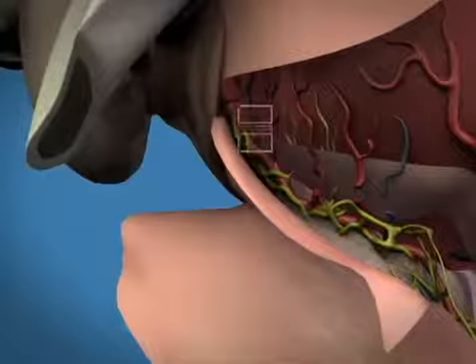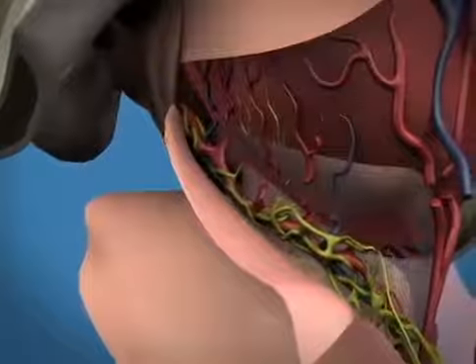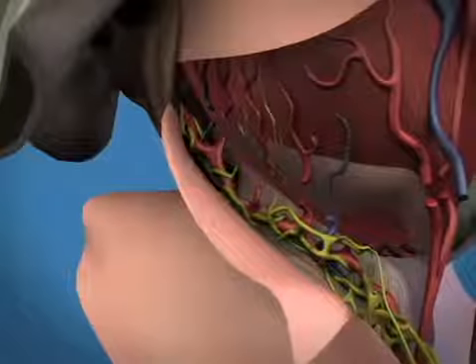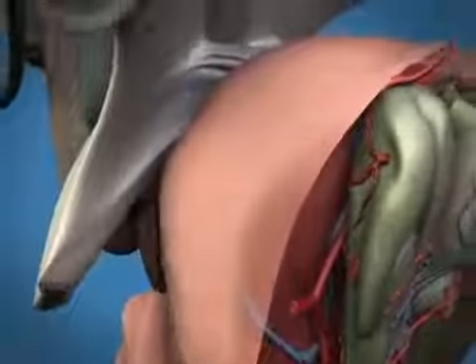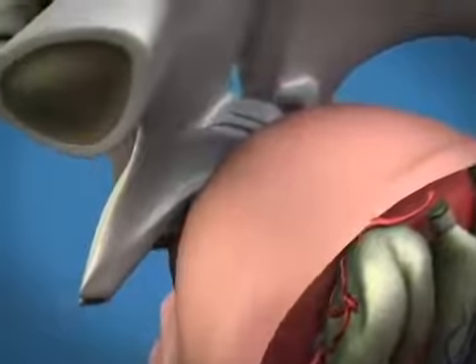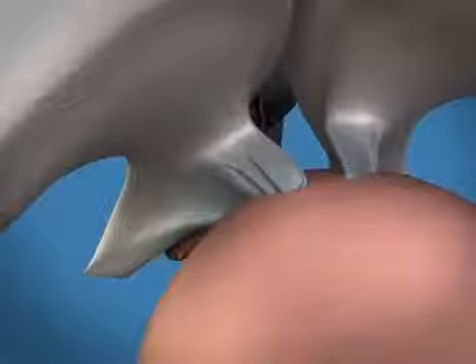Once completely released, the bundles fall away from the apex. This procedure is repeated for the neurovascular bundles on both sides. Another key step in the surgery is the development of the apical notch and transection of the urethra. At this point in the surgery, the prostate is attached only at the apex.